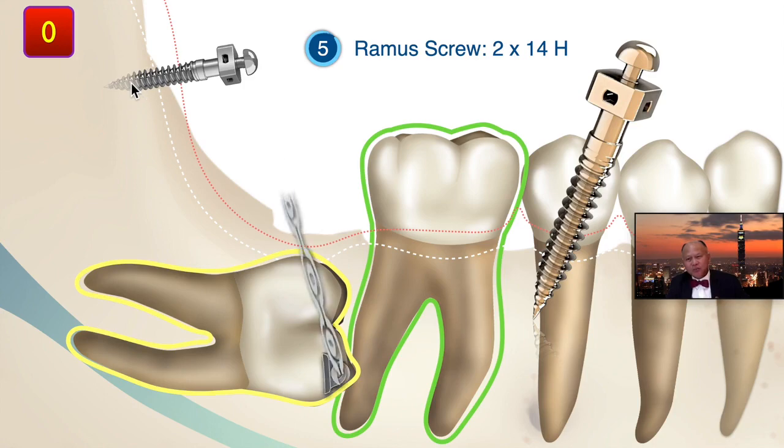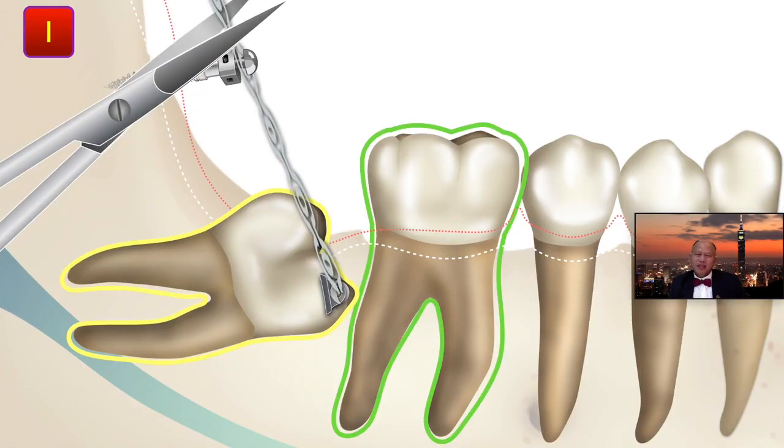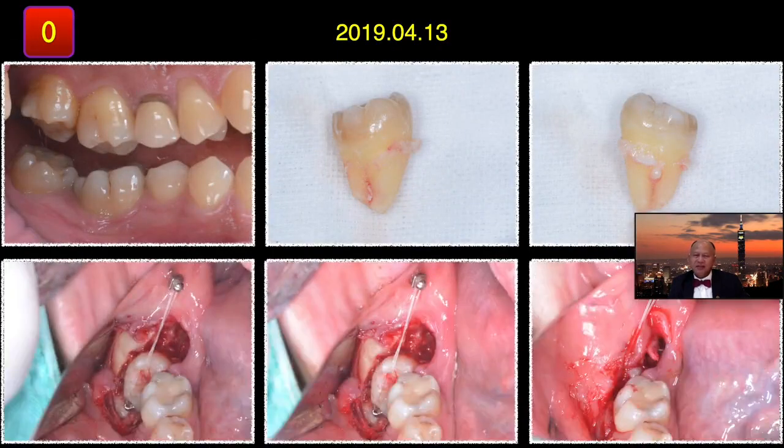And I always do manual insertion. I don't want to use low speed because low speed will entangle the soft tissue. So I hook on this power chain, and that provides a perfect counterclockwise movement, which is a pulling mechanic to upright this horizontal molar. One month later, I stretch this power chain and cut the extra. And one month later, I stretch again and activate. And this is how I take the third molar out, and that's the way I bond the eyelet, and hook on this power chain. And I also grind the bone.